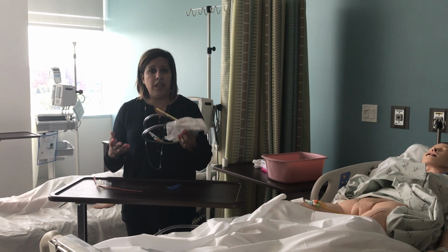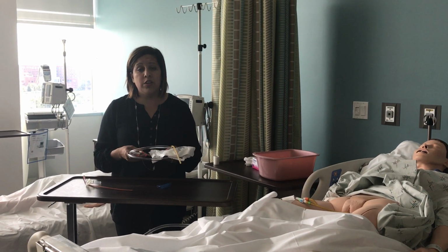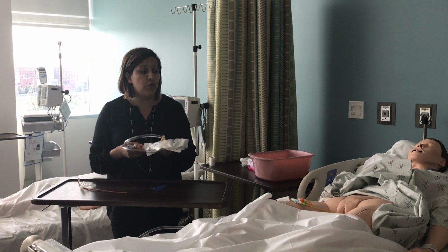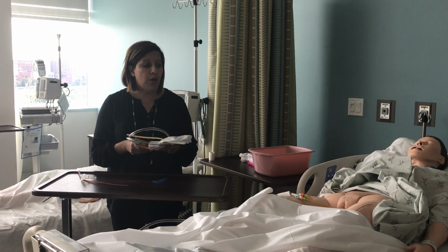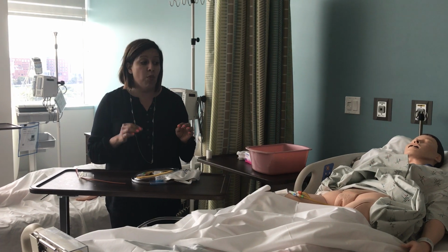So as a BNA, your role is very important in terms of providing good pericare and good hygiene, because one of the biggest things, like I said, is UTIs that can be caused by this. So I'm going to demonstrate some important key points of what you should be doing when you're providing catheter care.